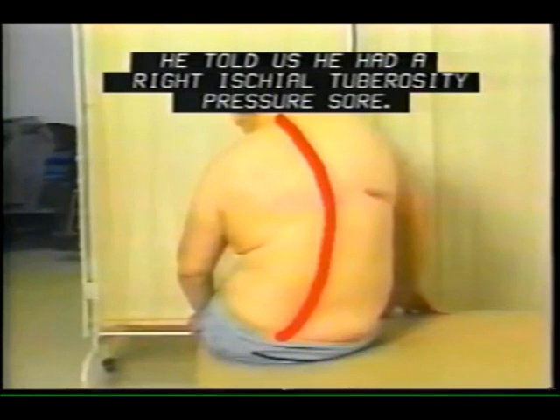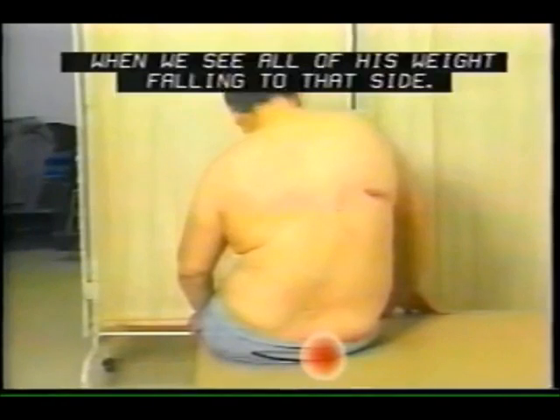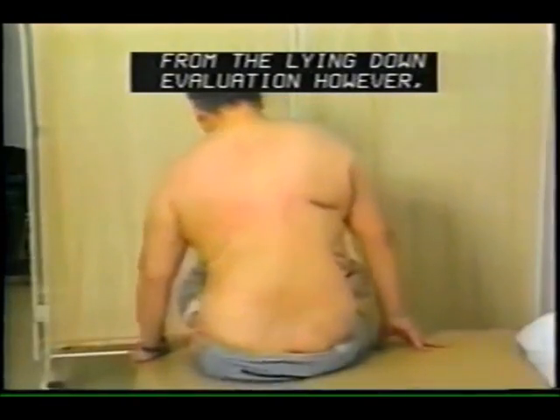Remember, from his interview, he told us he had a right ischial tuberosity pressure sore. Mechanically, we can appreciate why his skin broke down under the right IT when we see all of his weight falling to that side. From the lying down evaluation, however, we know that these deformities are flexible.